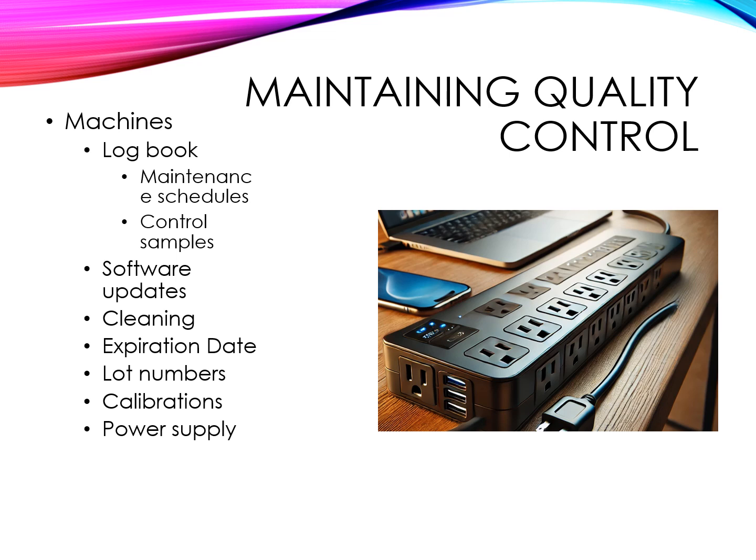So some of the things that we do to troubleshoot when the quality control doesn't pass is we may have to calibrate the machine. The machine may need to be cleaned, like the tubing or the filters, or maybe the waste needs to be emptied, the waste container on the CBC machines. We have to make sure our controls are not expired, or calibrators, and make sure we're using the right lot number.